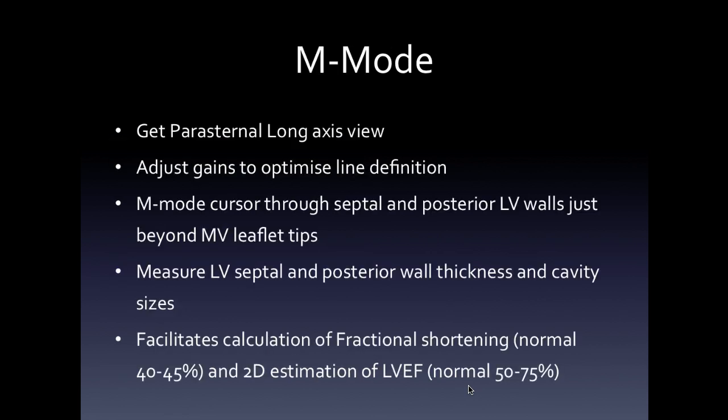The M mode has been around for a long time. It's the one that I think cardiac physiologists are often much better at than the clinicians, because I think we as clinicians are often trained to multitask, polytask, but there's a huge amount of value in the M mode. And a good parasternal long axis view will give you a very good estimate of left ventricular dimensions, which, as I said earlier, is the starting point in assessing LV function.